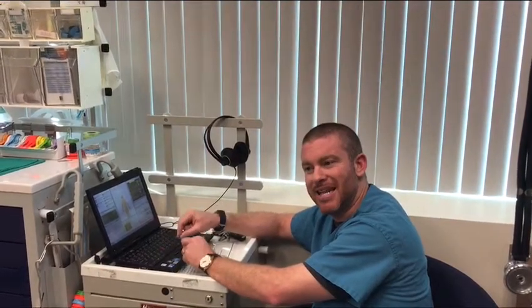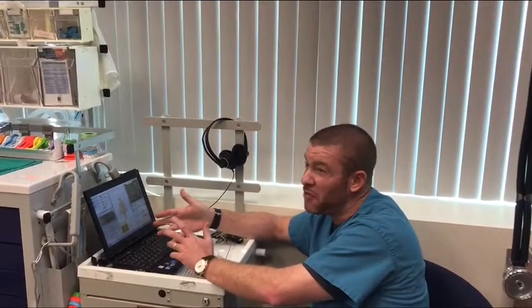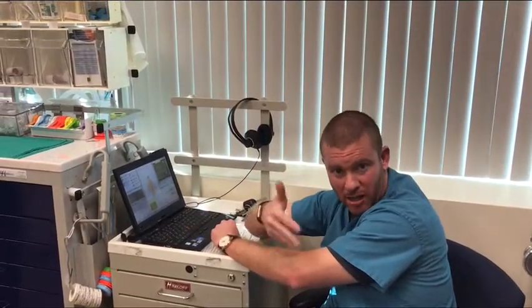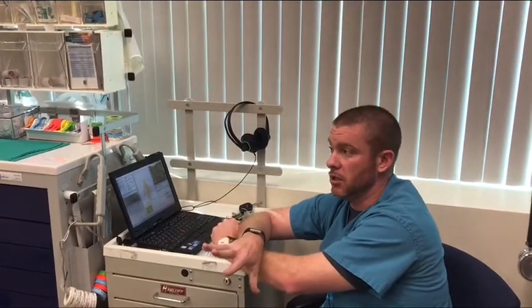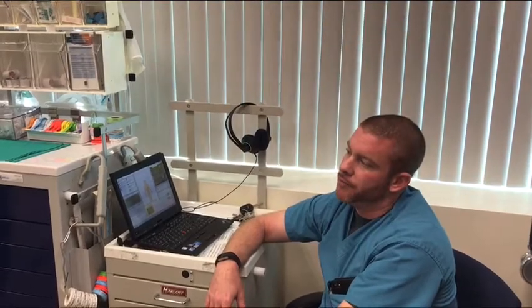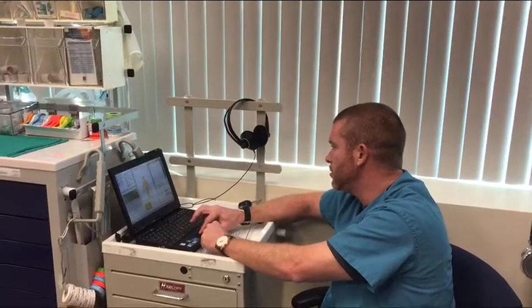No. So if we want to increase the tension of carbon dioxide in the serum, how would we go about doing so? We decrease the respiratory rate and your volume. So go ahead and you can do that. What I like to do on a patient our size is take down the volume and the rate to 4. I do 4 and 400. I would take the volume down to 400, and you can go 200 if you want. And how long are we going to wait for that CO2 to build up? About 2 or 3 minutes.